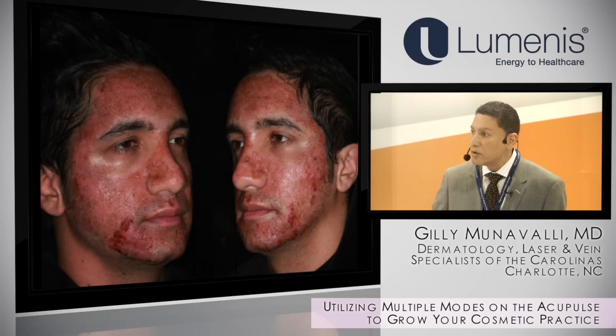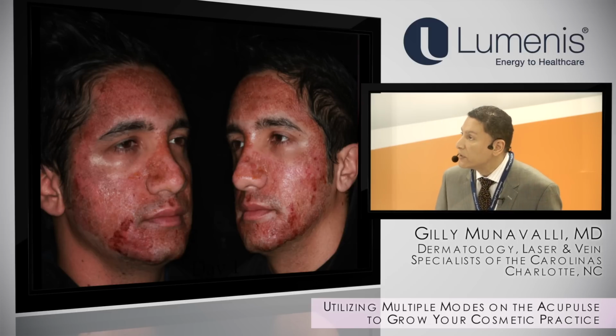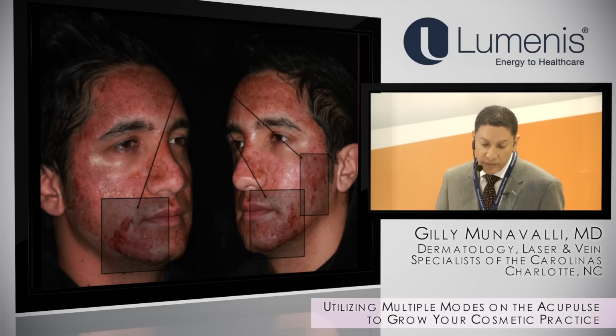This is some of Dr. Clementoni's pictures, just talking about the acne. This is actually a very good result with acne scarring, and it demonstrates that you target your depth depending on what lesion you're treating. So you can see he's gone deeper in the areas of the acne scarring, a lot more superficial in areas where he didn't need to. So that's what I really like about this treatment.